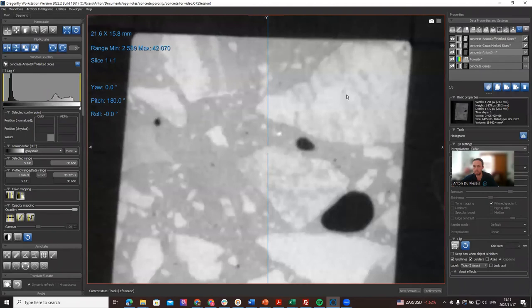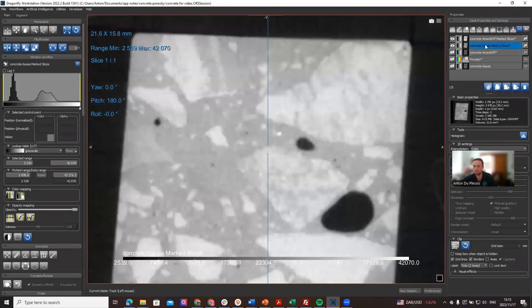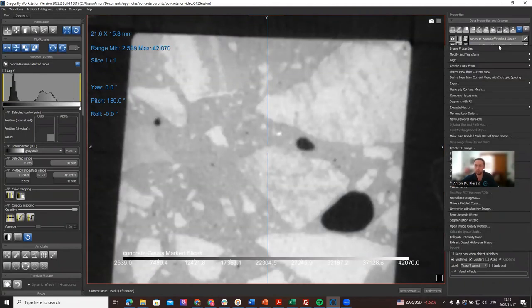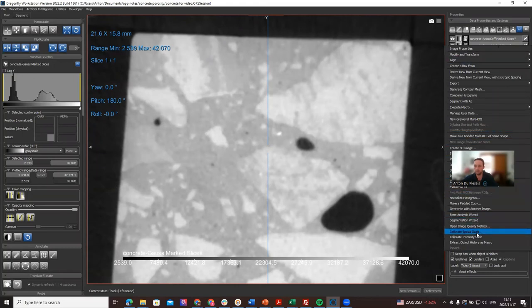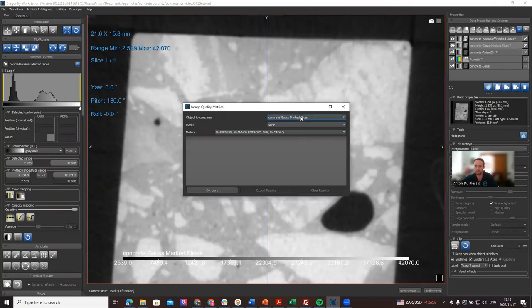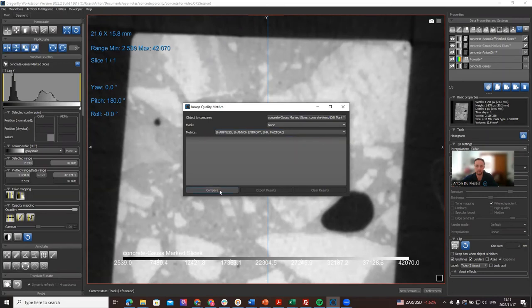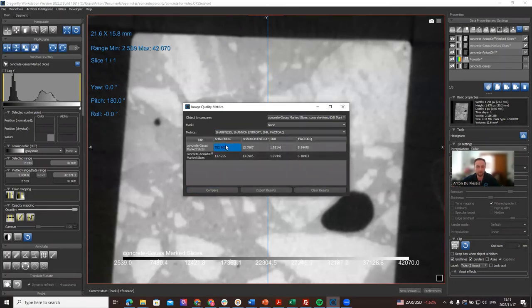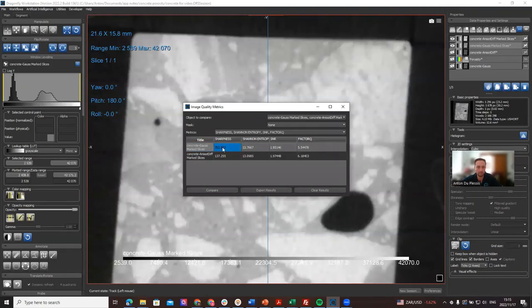In that way we can see both of these on top of each other. These are simply single images. If I now right-click on either one of these, we can go to open image quality metrics down here. Now we can select both of those single slice images and we can compare them.